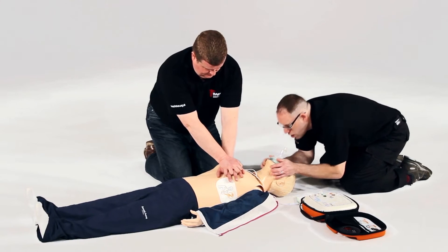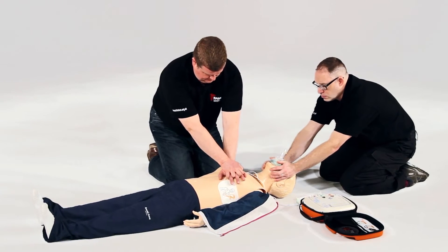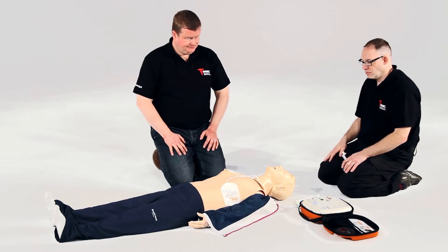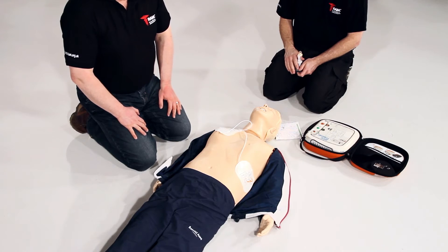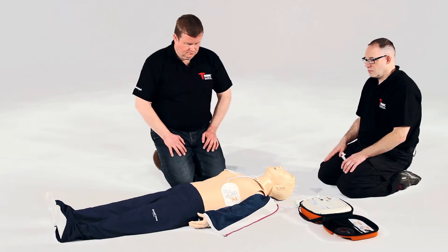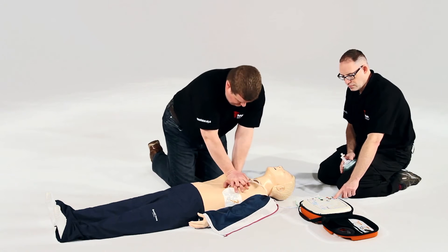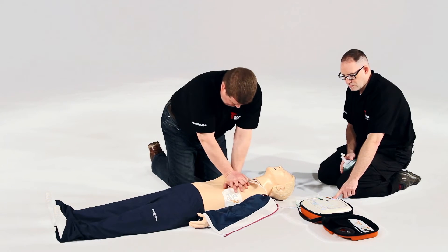Do not touch the patient. Analyzing heart rhythm. Stand clear. Do not touch the patient — no shock advised. Begin CPR now. Carry on. Press the flashing blue I button for CPR voice prompt.